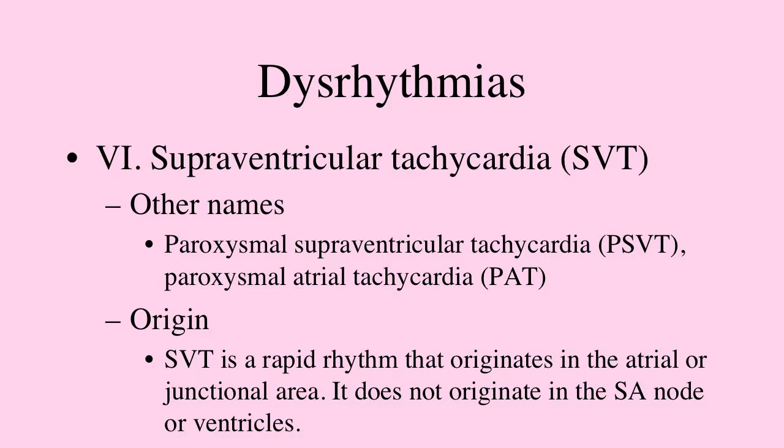In fact, that second one down is a great example. The third one down, again, goes into it fast, and the fourth one down just shows it being fast. But you can see that the QRS complexes generally look normal, and they're just going fast for a period of time. And that's the main information and examples to have on SVT shown on page 53.